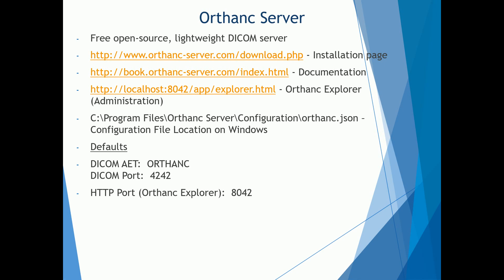You're going to download the Orthanc server, which is a lightweight DICOM server that kind of mimics a PAC server. If you look back at the intro course, you'll see that DICOM is the standard form of communication. This DICOM server will be able to send and receive images.